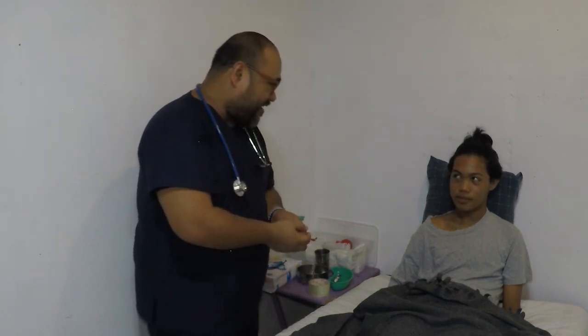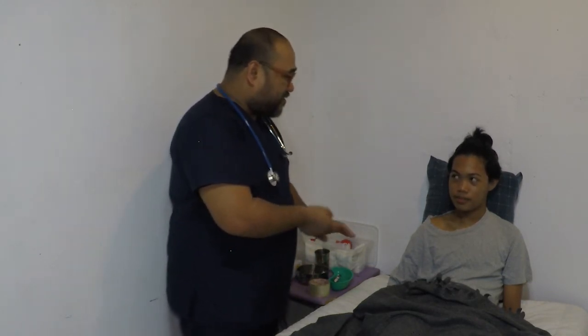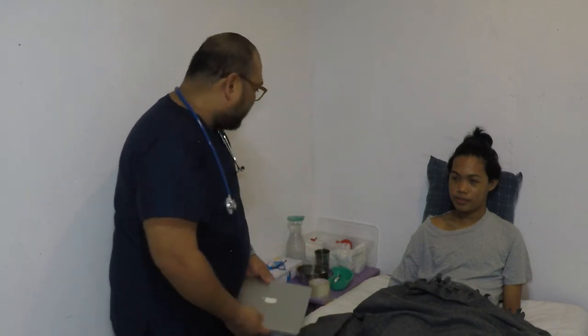Alright, that's it guys. We already did the insertion of the tubing. Then we fed our client through nasal tubing, and we also did the removal of the tube. So thank you so much, sir, for cooperating with me during this procedure. I hope you'll feel better and you are full now. And then I will put you now, sir, on a comfortable position.